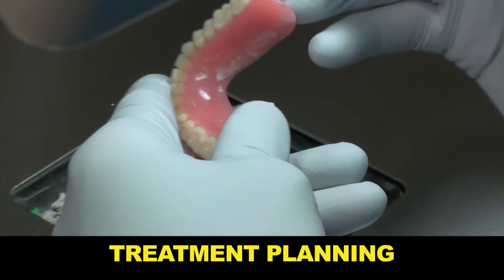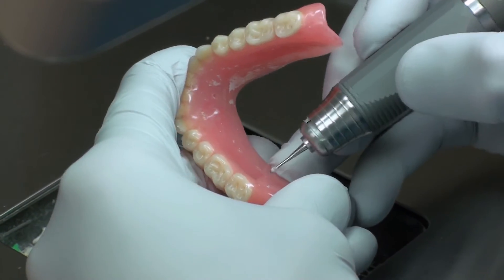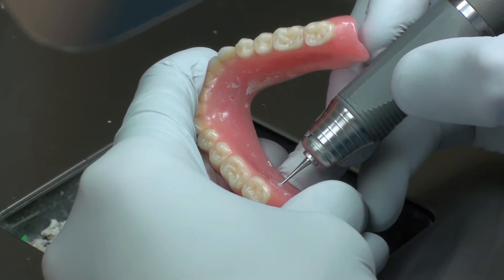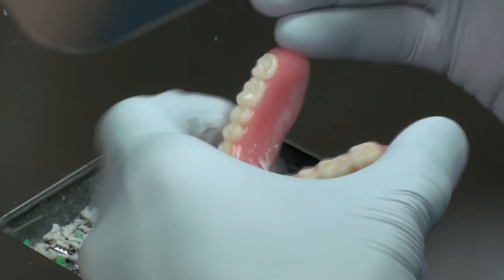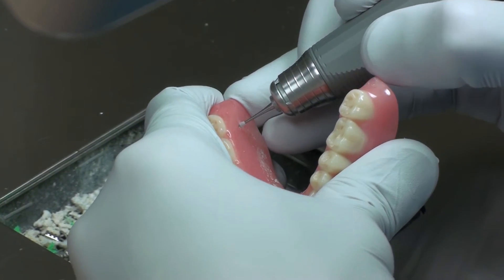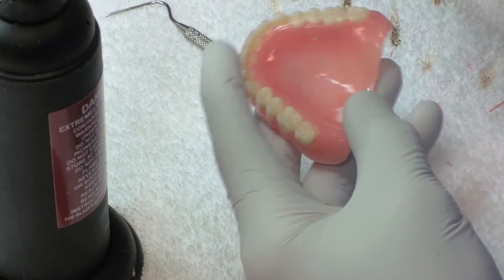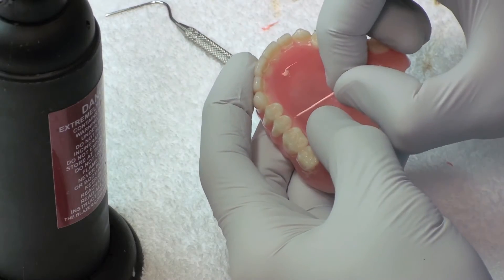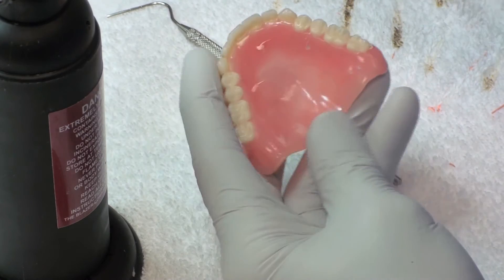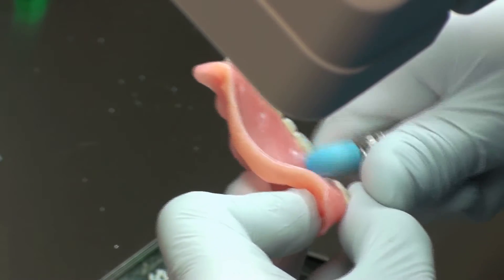Because the occlusion, aesthetics, and VDO of the patient's existing denture were correct, it was modified to serve as a CBCT scan appliance. Prior to her imaging appointment, we placed six fiduciary markers in the lingual flanges of her lower denture. The indentations were made with a number six round burr to one-half depth with spacing approximated equally around the flange, then filled with warm gutta percha and the excess was polished off using a rubber wheel.